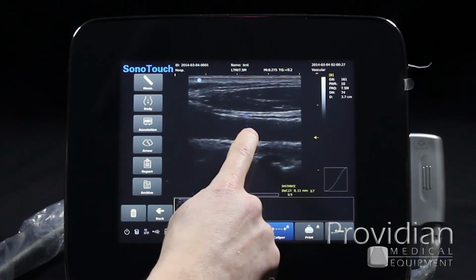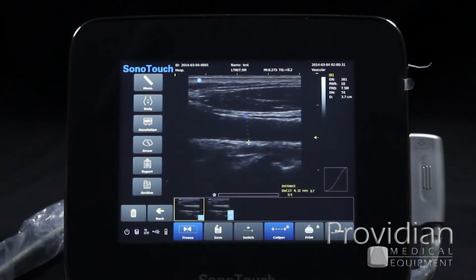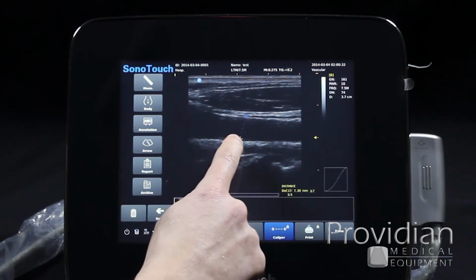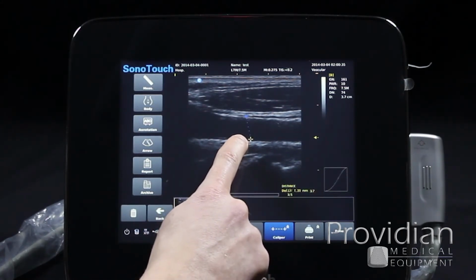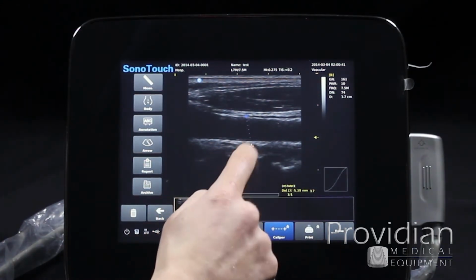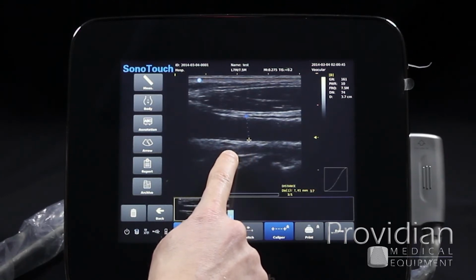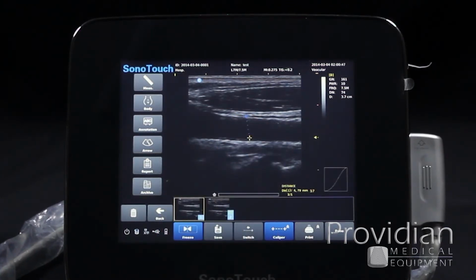and drag. And I don't know if you can see it very well, but there's a blue line here, and it's showing my distance here. I'm clicking and dragging this caliper around to get my measurement. Notice I can click away from it so I can see it better.